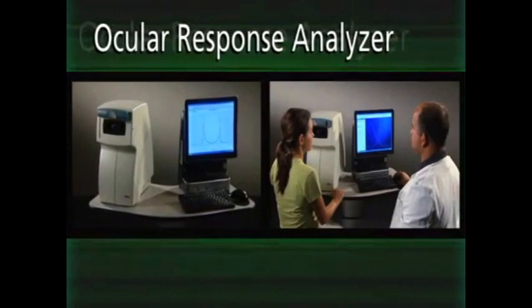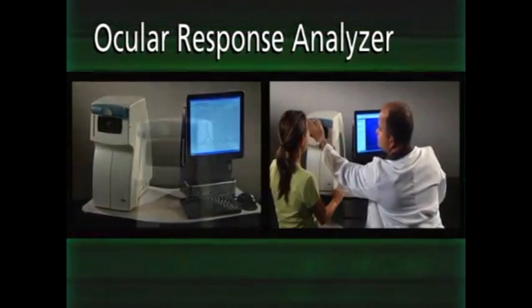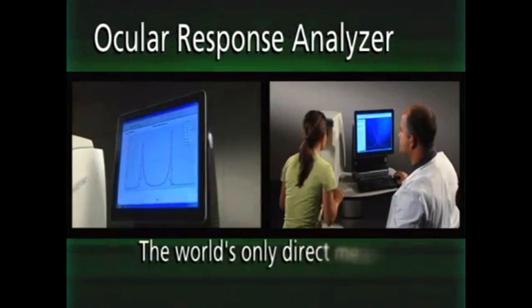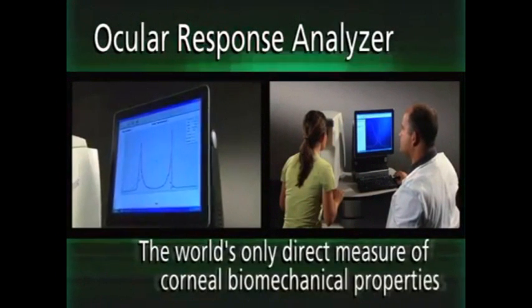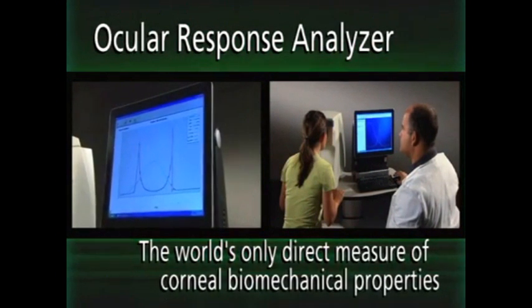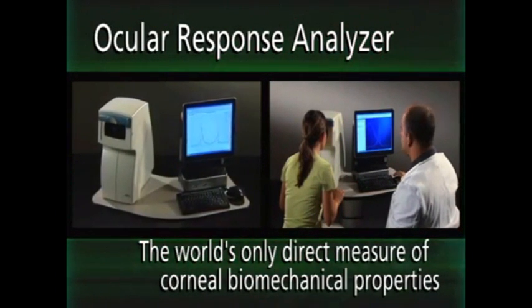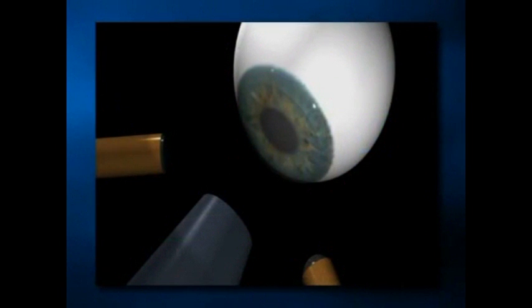The Reichert Ocular Response Analyzer utilizes a patented dynamic bi-directional applanation process to present the world's only direct measure of corneal biomechanical properties and a more accurate assessment of intraocular pressure.